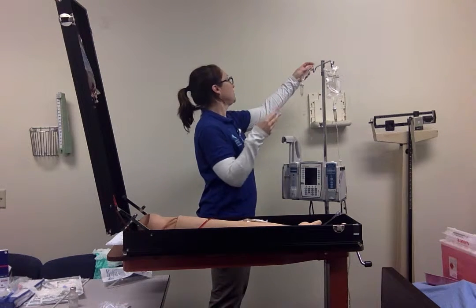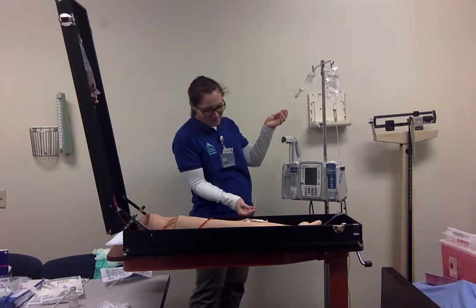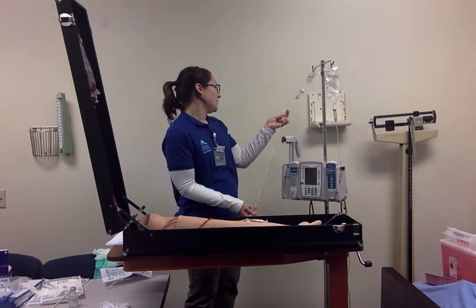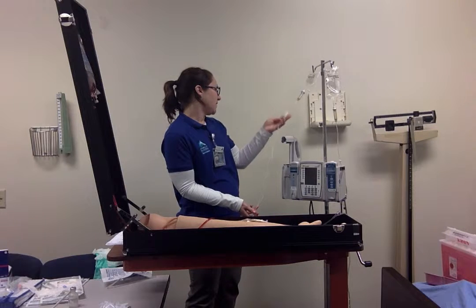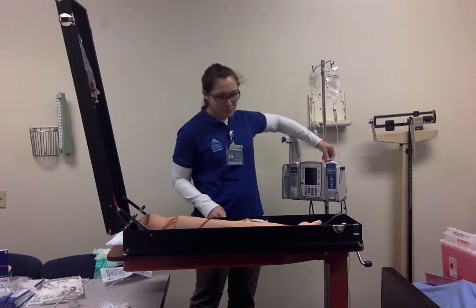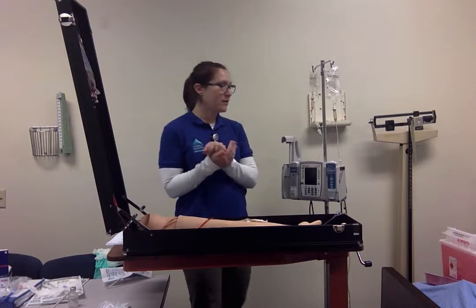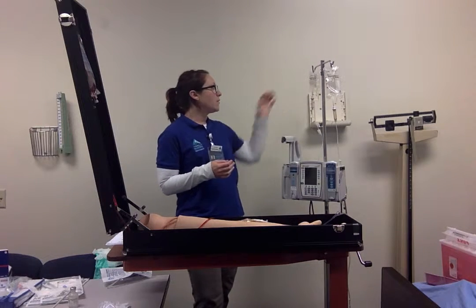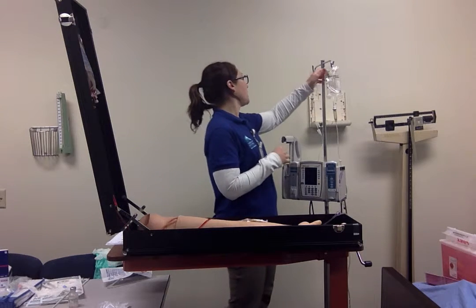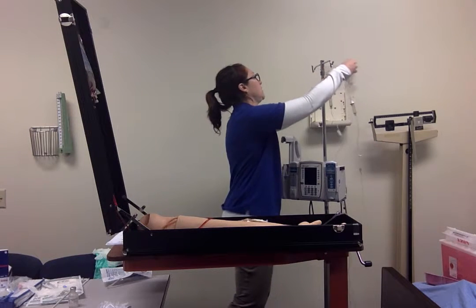I'm going to set this over here for the time being, and I'm going to go ahead and make sure that, okay, it's going. So there's no air. Once there's no air, I've got that set to go. I'm going to clamp it and set it aside. All right, I want to make sure that I next label the tubing, letting everybody know that I'm the one that prepared it, the time and date that I prepared that. And then just prepping this. So I'm going to go ahead and hang that first and getting this ready to lower.